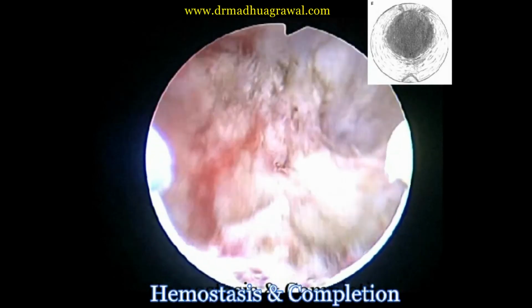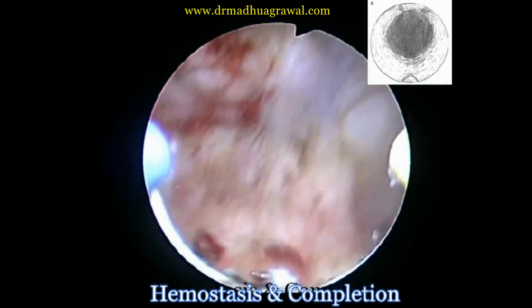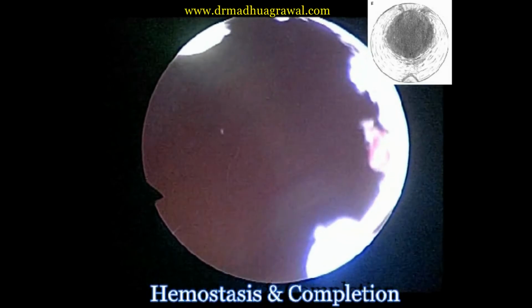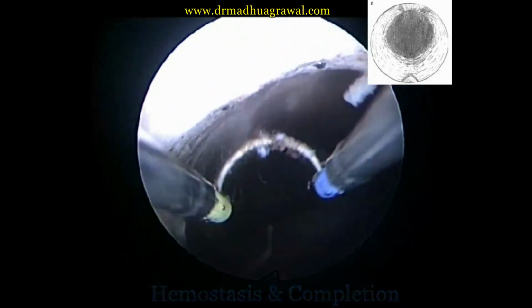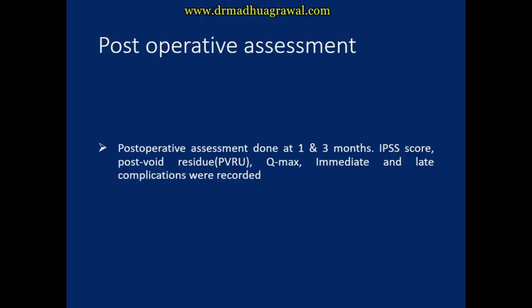Here, the clear and open prostatic fossa can be visualized with complete hemostasis. Postoperative assessment was done at 1 and 3 months following TUR, post-void residual urine, IPSS score, Qmax. Immediate and late complications were recorded in the study.